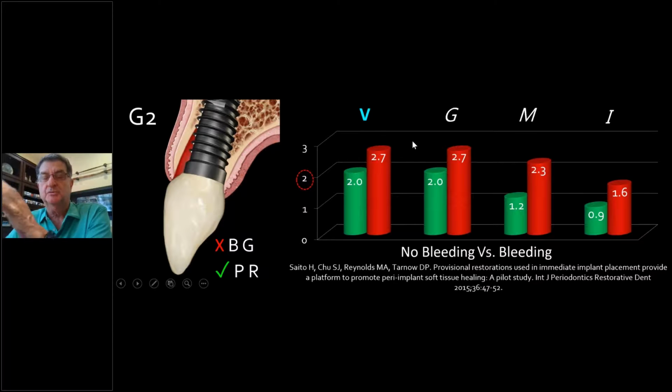So we don't disrupt this until 4 months. Once we put that temp in, we take our time to make a nice temporary. Let that tissue heal and consolidate and mature for a minimum of 3, but ideally 4 months. And so that's what we do. We published this again a few years ago.